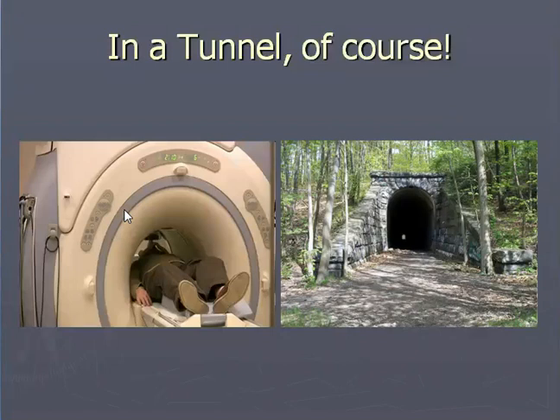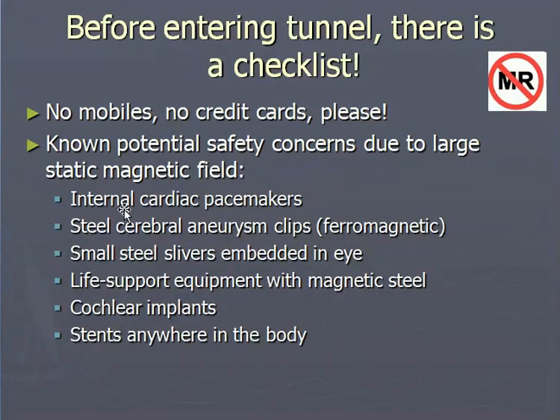This is a closed bore, high power magnet. Now there is a checklist when a patient undergoes the MR examination or goes into the tunnel.